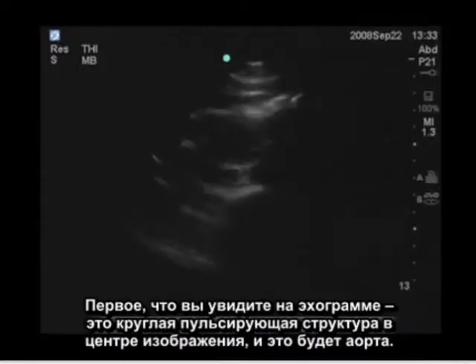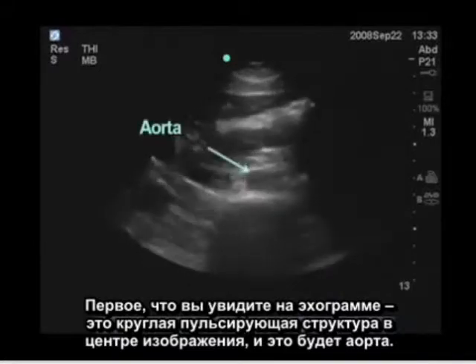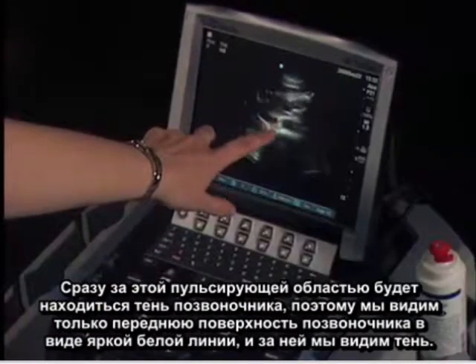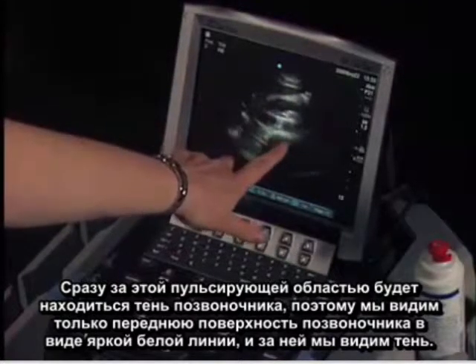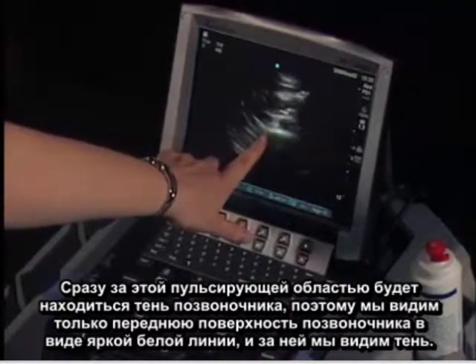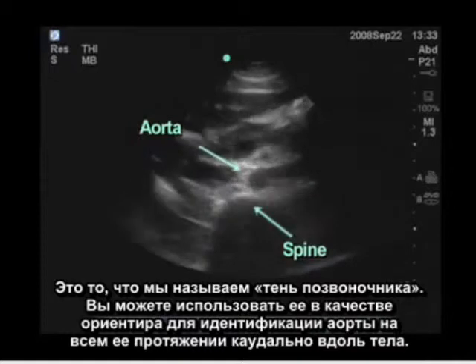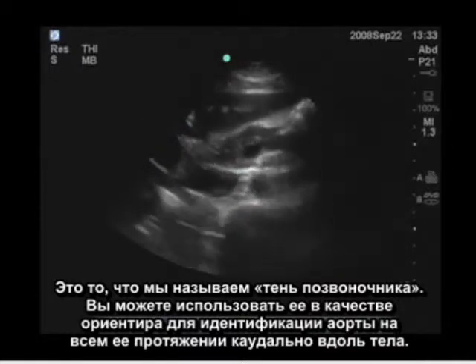The first thing you're going to see on the ultrasound image is a round pulsating structure in the middle of the image — this will be the aorta. Immediately posterior to this round pulsating area will be the shadow of the spine. We see the anterior surface of the spine as a bright white line, and behind it we see a shadow — what we call the spine shadow — which you can use as your landmark to identify the aorta all the way down the body.